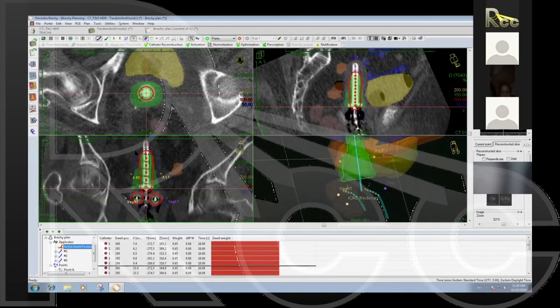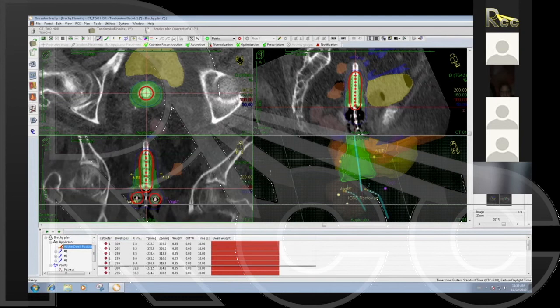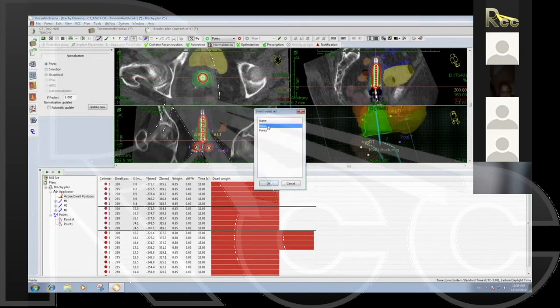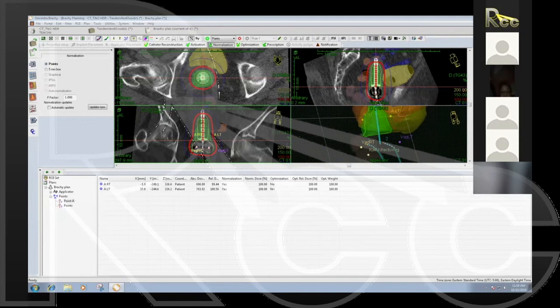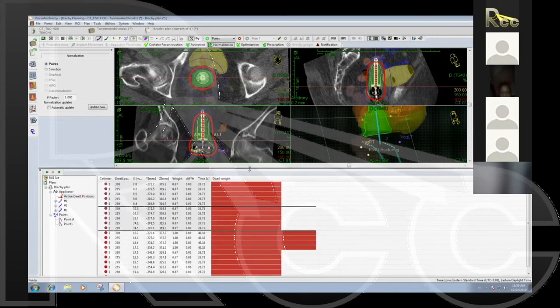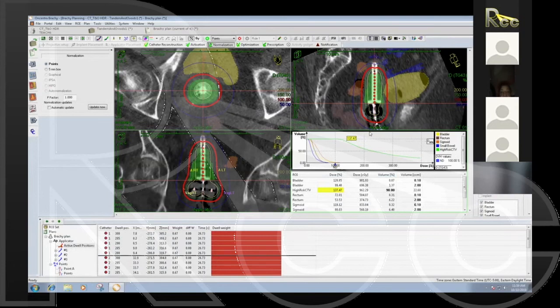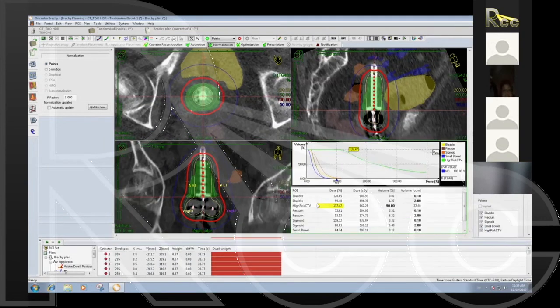Now with standard loading, I normalize to point A — and there it is. Would I treat that way? No, because it's too hot. Loading up the dose volume histogram: high-risk CTV D90 is 137% — really hot. Bladder is almost 7 gray. Sigmoid is 5.6 gray. Rectum is actually really low. We are obviously over-treating.